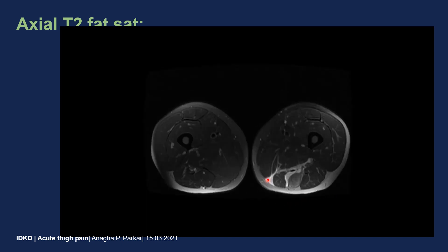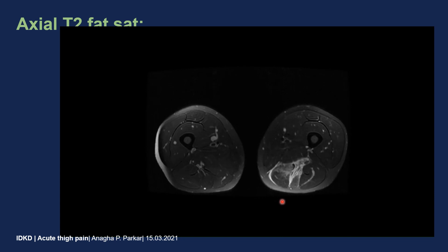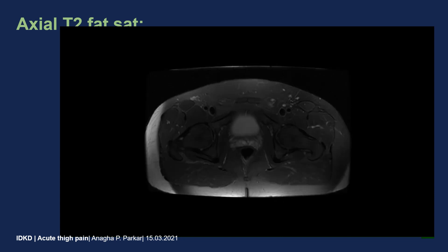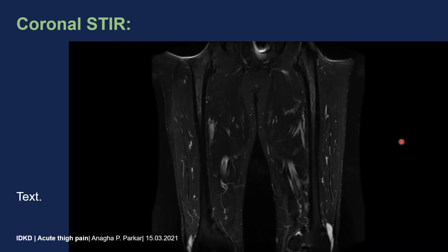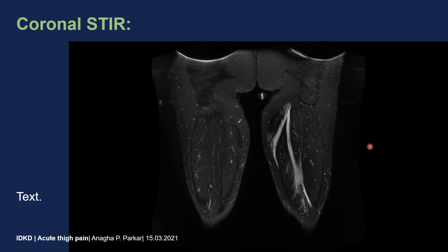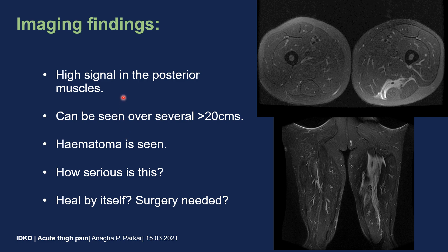There is also some hematoma. Then there's the coronal series. We see high signal in the posterior part of the muscles, and this can be seen over a long area — more than 20 centimeters. We do see a slight hematoma.